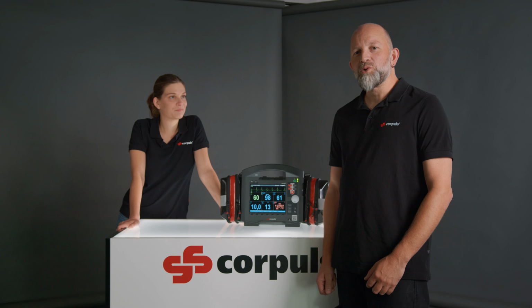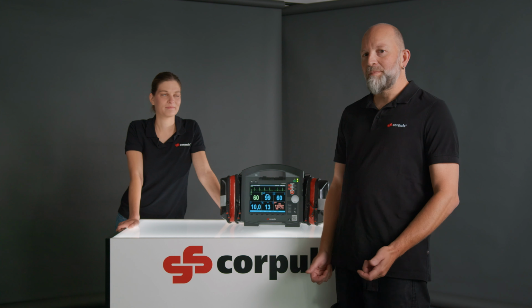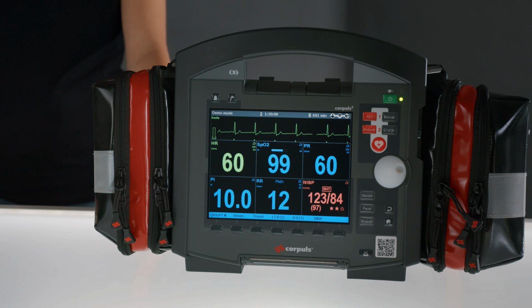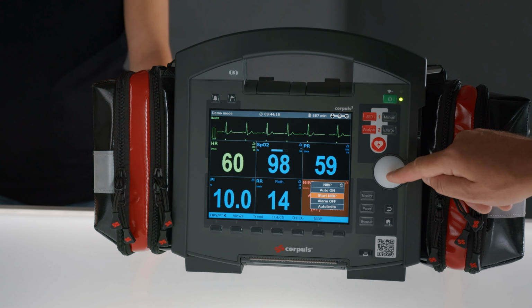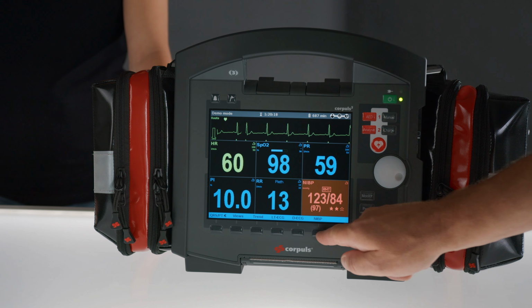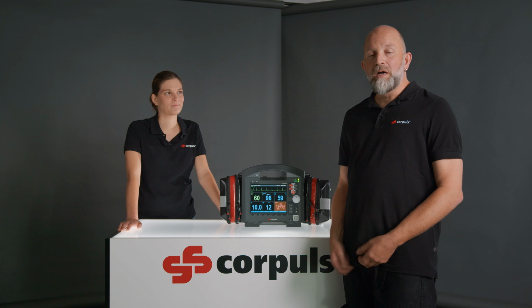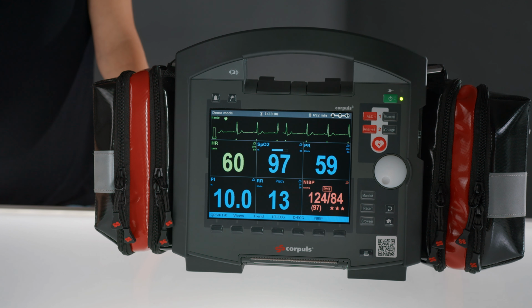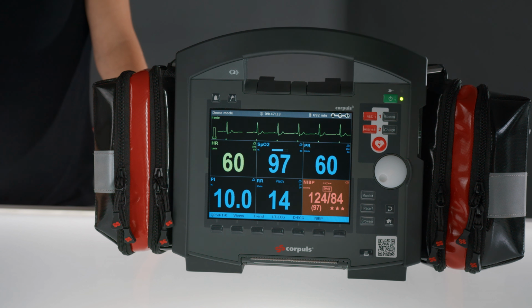In monitor mode, we have innovations in non-invasive blood pressure measurement, ECG upload and alarm management. We now have the option to start non-invasive blood pressure measurement via the parameter context menu. You now also have the option of starting or stopping the interval measurement of non-invasive blood pressure via the parameter context menu.